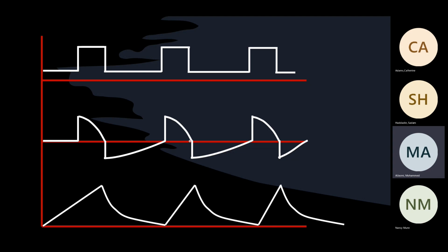The flow is not a straight, stable flow. There's a little bit of concavity at the top of the flow, and that goes with a little bit of patient effort. There's the patient doing something during this breath. And that's why this is PC, pressure control. Yeah, that's right.